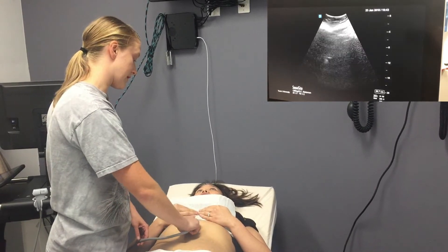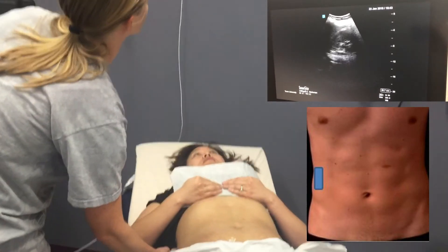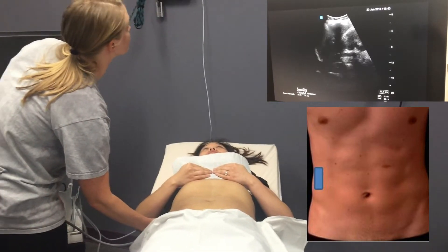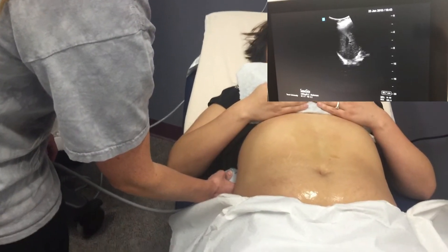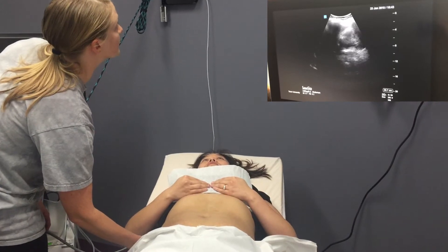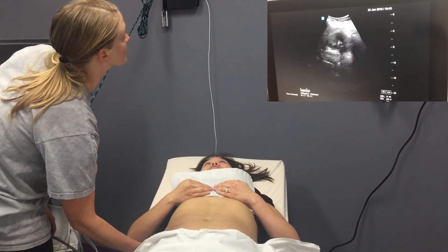Then we'll move on to the right upper quadrant, where we can see the kidney and the liver. We'll also check above the diaphragm — we want to make sure there's no fluid above the diaphragm in the lung and that we can see the reflection of the liver above the diaphragm. We also want to make sure there's no fluid in Morrison's pouch and that the caudal tip of the kidney can be visualized to confirm there's no fluid between the liver and the kidney.